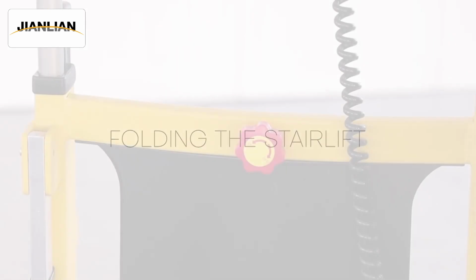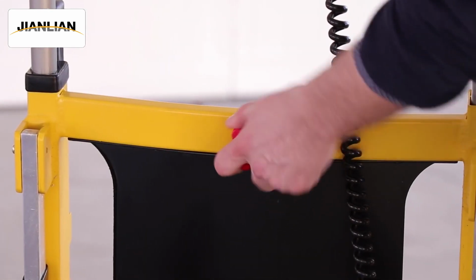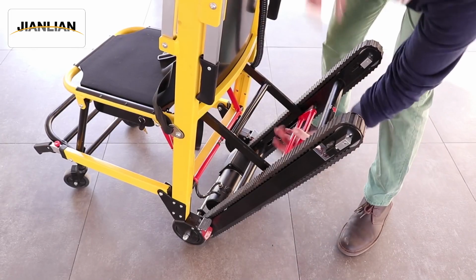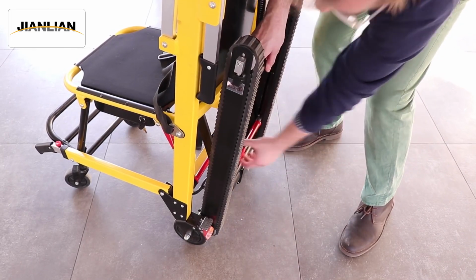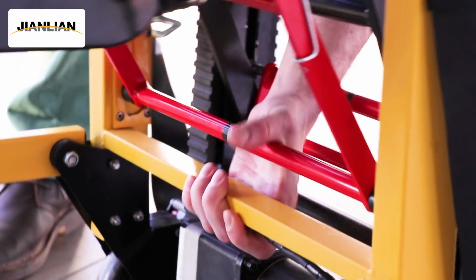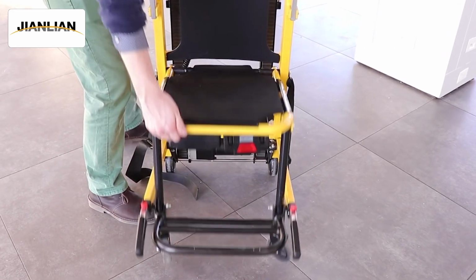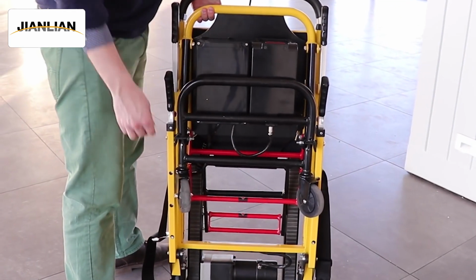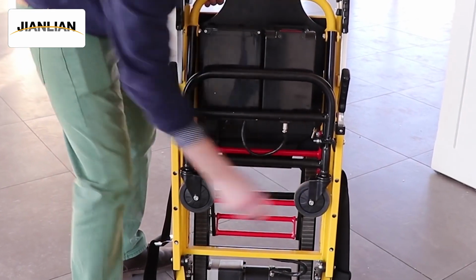To return the stairlift to a folded position after use, rotate the red knob and slide the handlebar all the way down the back of the stairlift. Fold the tracks up and lock them into place. Pull the inner red bar towards the arrow while leaning the back of the seat forward, then fold the seat up. Fold in the footrest and make sure the wheels are flat against the front.